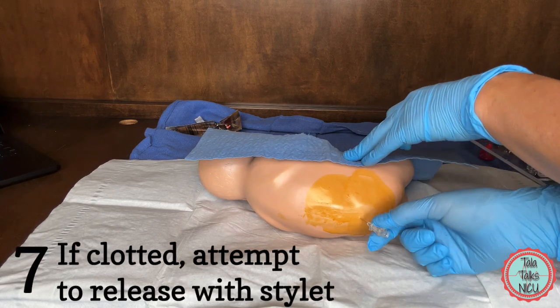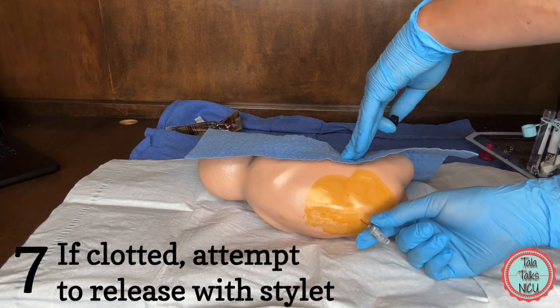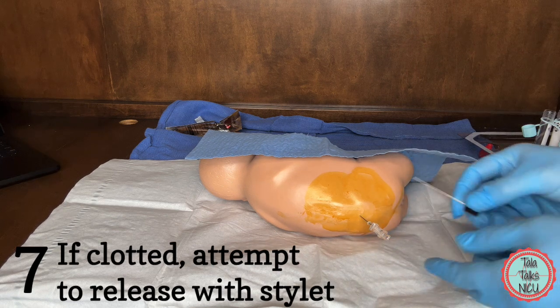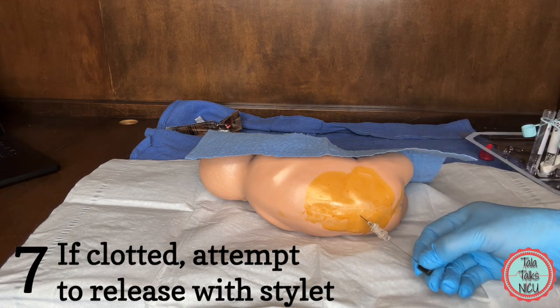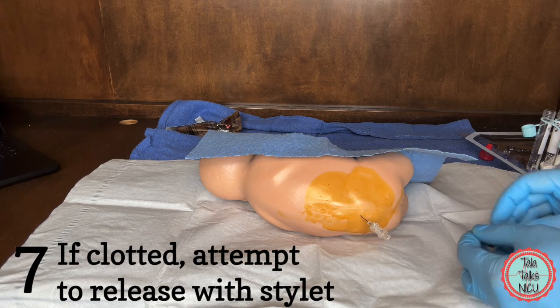Seven: there is a clot somewhere in the line or the needle and the fluid won't flow. There isn't a lot to do here but take the needle out and try again. If you think that the clot is right there at the hub of the needle, sometimes you can use the stylet to try and get that flowing and let it start coming out that way.